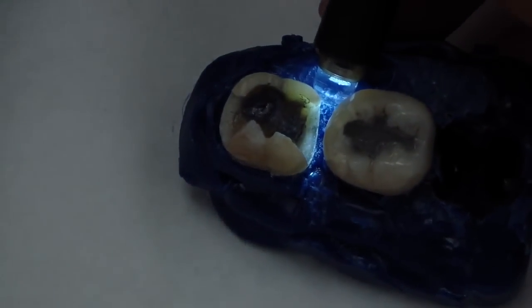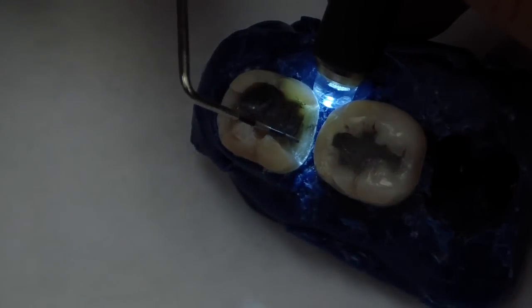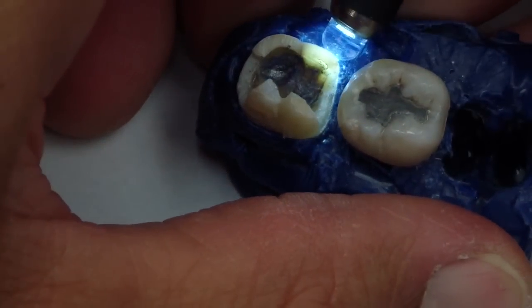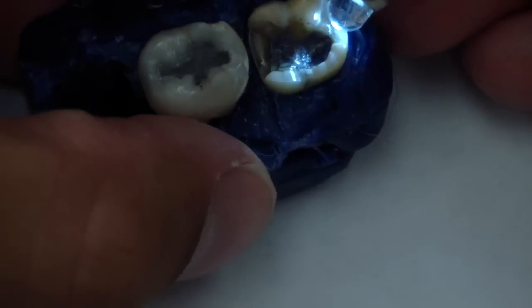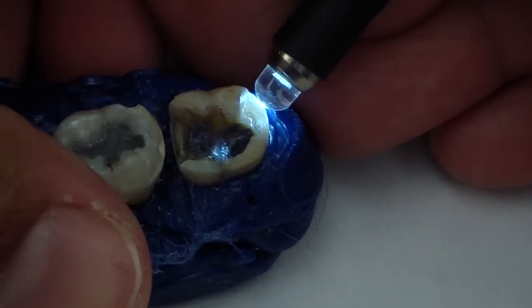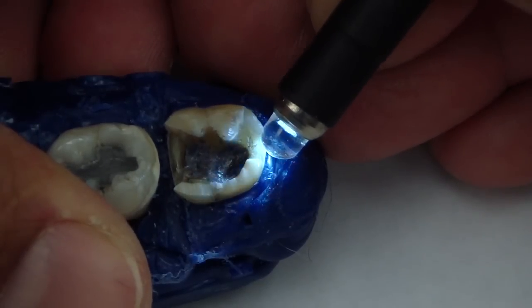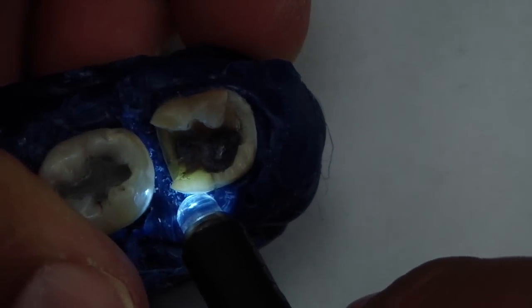It's fairly difficult to see through the video. The light is not attenuated here, so this is more of a stain. The light is continuous all the way through, so we wouldn't consider that a fracture. And same on the distal — let's take a look at the distal here. When we shine the light, it is continuous all the way through, so there is no fracture line here, as compared to that right there.